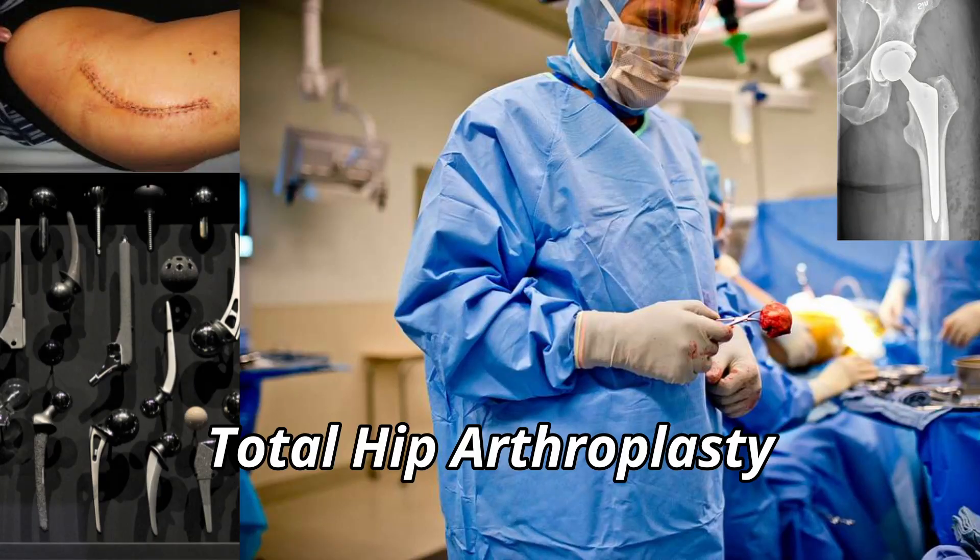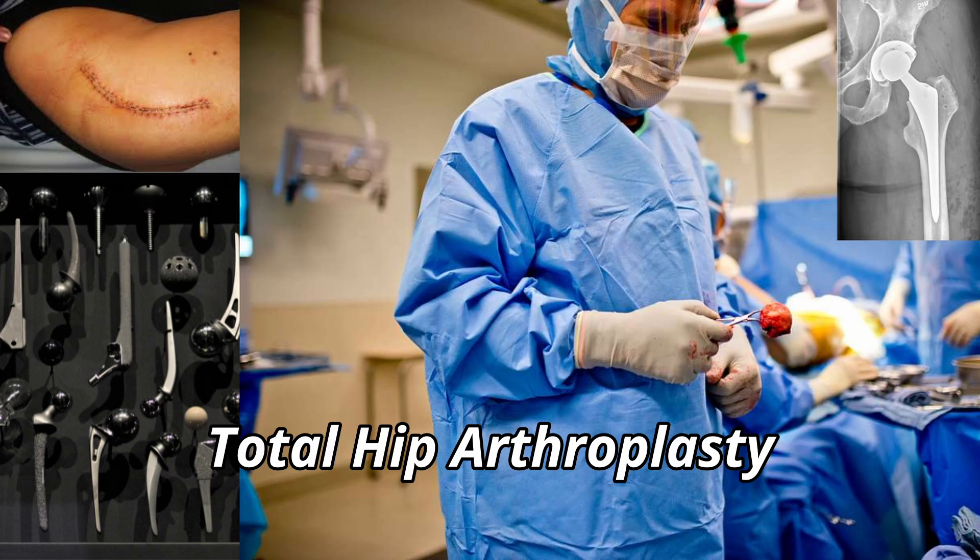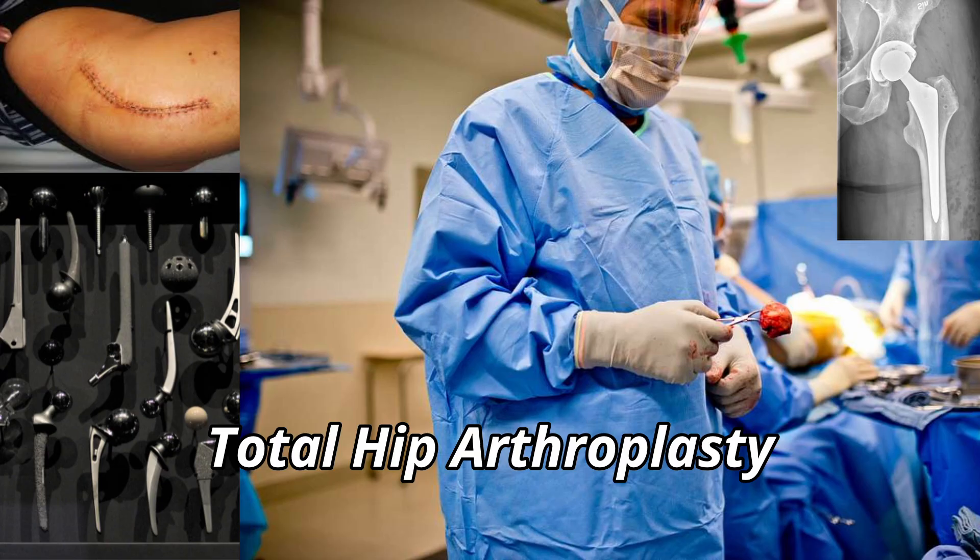Welcome to Ellie Scrubs In. Today we're scrubbing in for a total hip arthroplasty, or total hip replacement, one of the most transformative procedures in orthopedic surgery. We'll walk through the standard posterior approach with detailed surgical steps, highlight common variations, describe the instruments used at each stage, and point out key pearls and pitfalls.